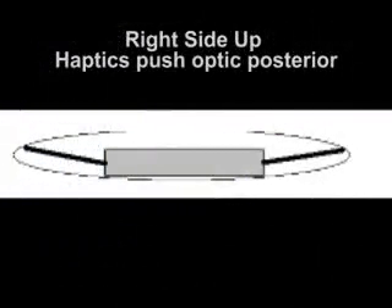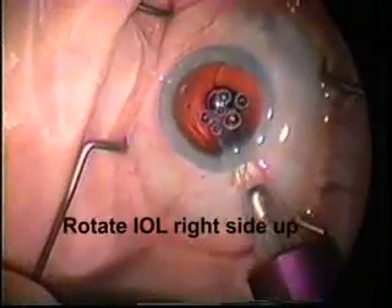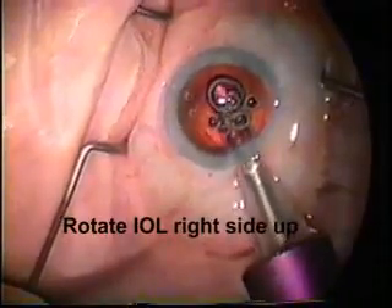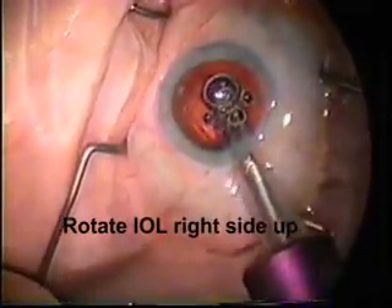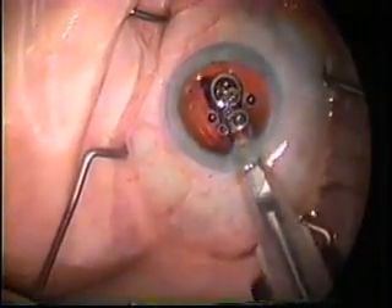Here's a patient of mine that had a myopic surprise postoperatively. Notice that haptic which is visible — it's upside down. It looks like an S. When the haptics are right side up, they tend to push the optic down. When they're upside down, they push the optic forward, which gives you a myopic surprise. So here the lens was rotated by twisting the cartridge to make sure that the intraocular lens was right side up.